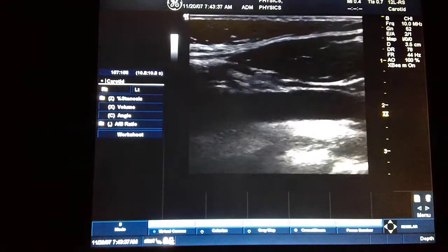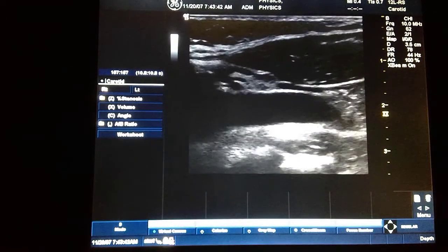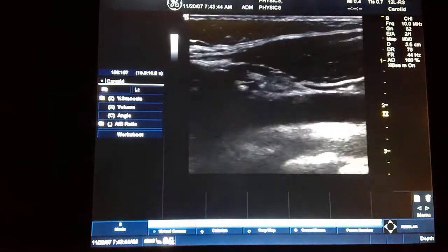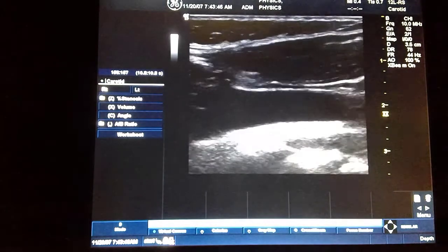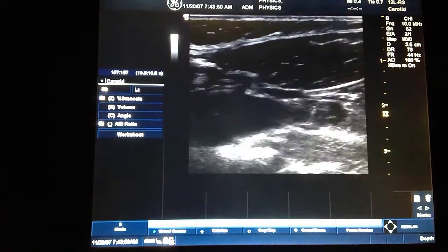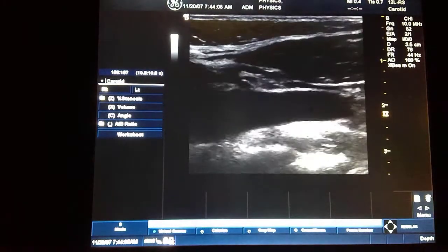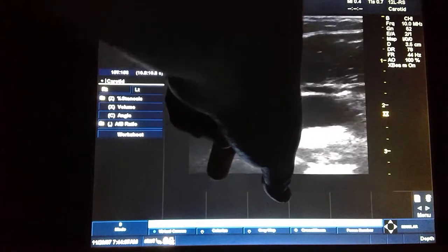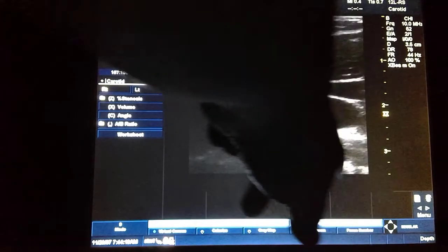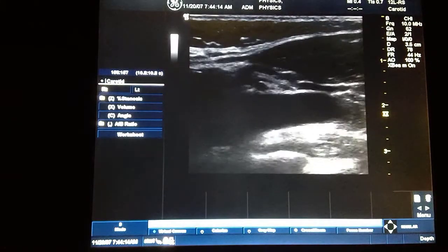This black bar that's going through the middle here is my carotid artery. If I can get it straight across the screen, we will be coming at that artery with a 90-degree angle, or normal incidence. We are pretty close to 90 degrees. We've got nice crisp borders. So 90 degrees is awesome for our black and white pictures. It gives us really nice reflection back to the transducer.